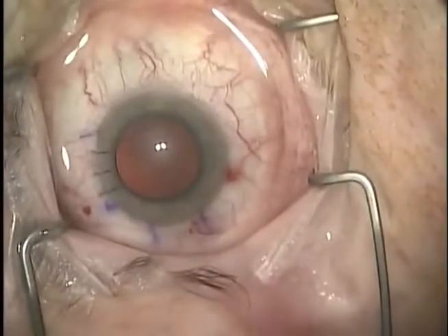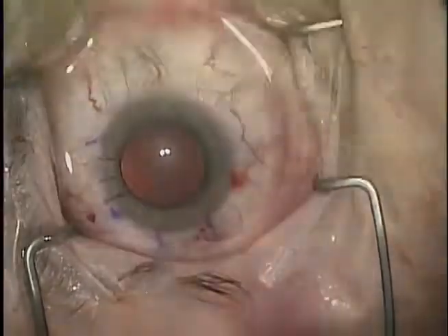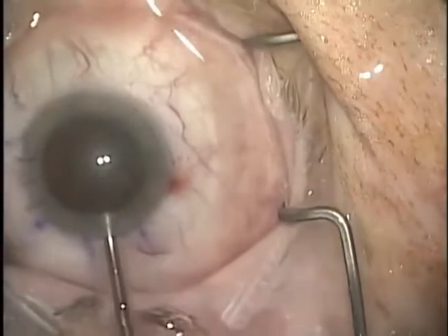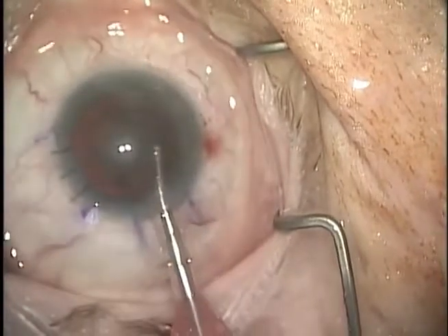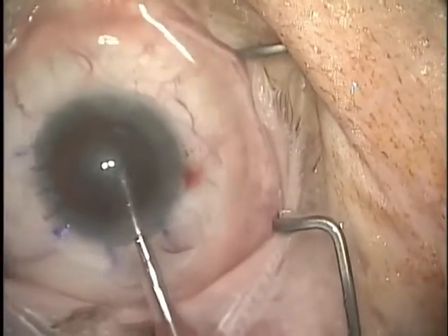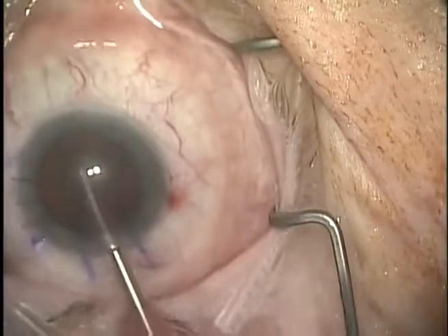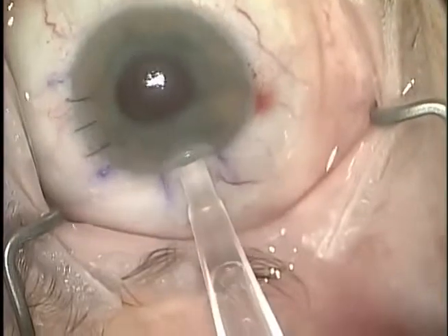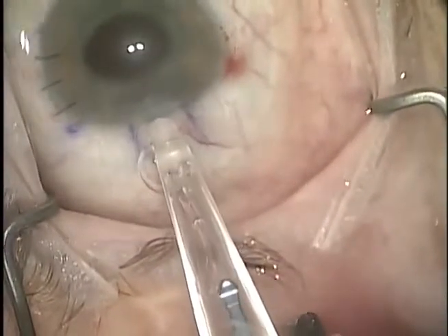The superior wound is closed with three 10-0 nylon interrupted sutures. Cataract extraction proceeds through the 2.2mm temporal incision. The one-piece acrylic lens is injected through the temporal incision into the capsular bag.